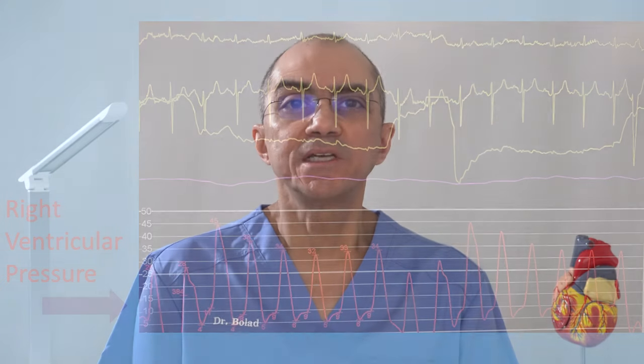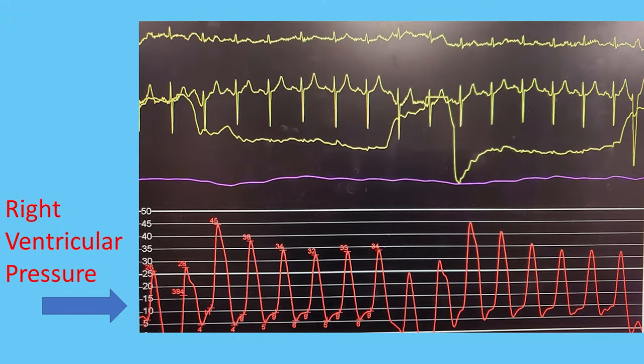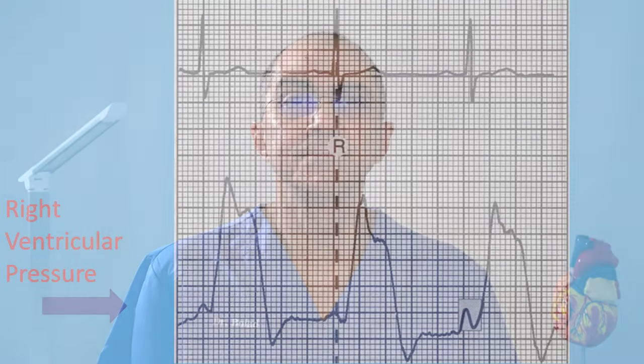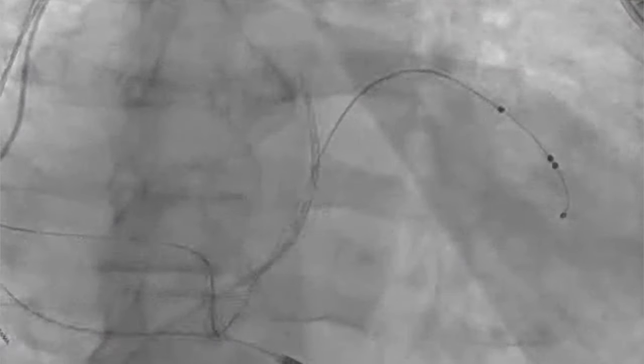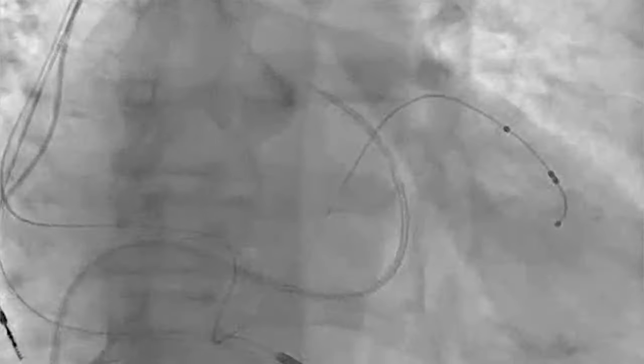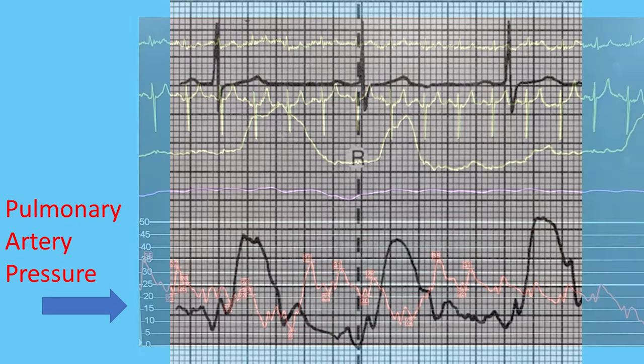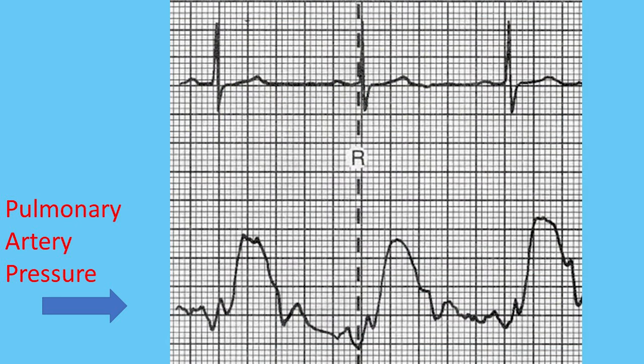I then guide my catheter to the right ventricle — this is what I see on the monitor — and here is a schematic representation of how it should look. I then pass my catheter up from the right ventricle to the pulmonary artery, as can be seen here in this video. This is the pulmonary artery pressure that I see on the monitor in front of me, and here is a schematic representation of how it should look.